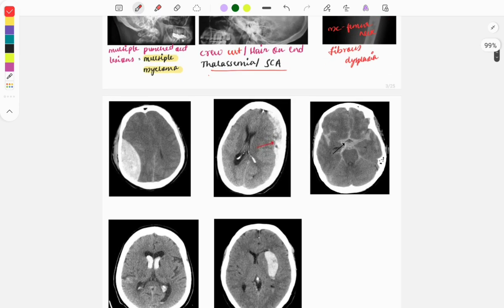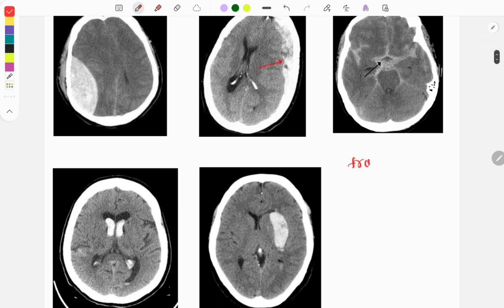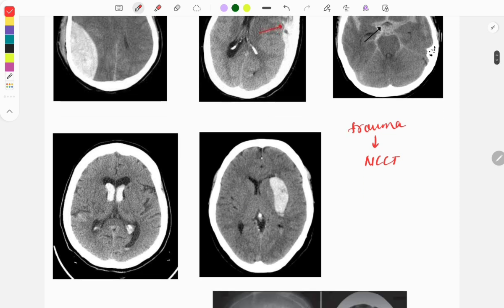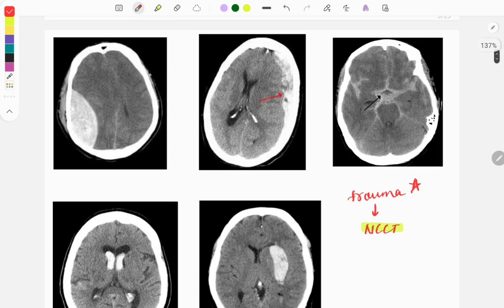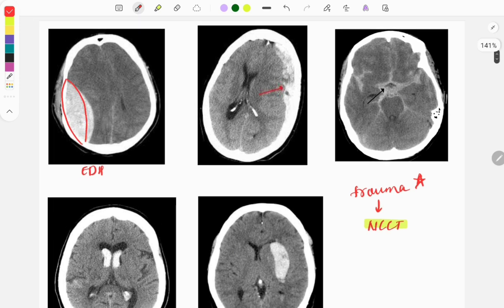Now let's see images related to brain hemorrhage. Whenever a trauma patient comes to the emergency, the first investigation is non-contrast CT — this is asked multiple times as a one-liner. These are findings seen on non-contrast CT. The finding seen in extradural hemorrhage (EDH) is a biconvex lens shape — asked multiple times. You need to remember these images as questions are repeatedly asked in relation to surgery and medicine.